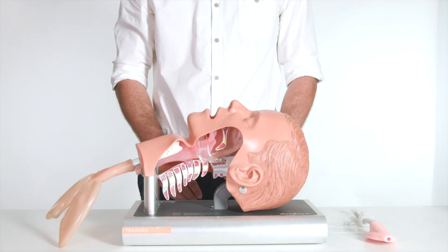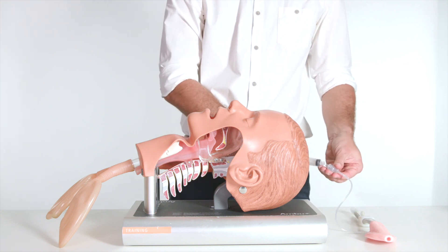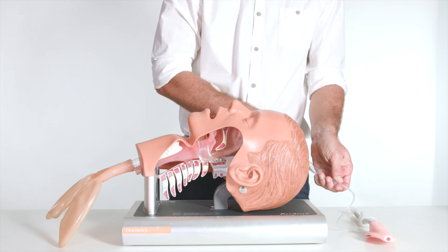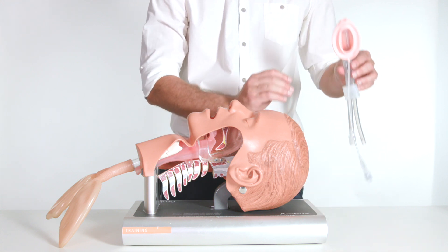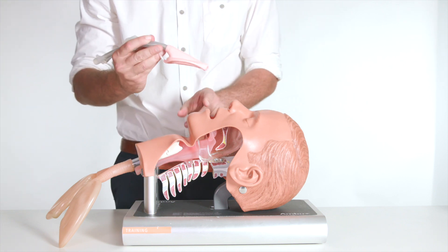In this video we'll be demonstrating the method of insertion. Check the cuff inflation before use and place on a flat surface, then deflate the mask cuff with a syringe, or the mask may be inserted semi-inflated. Lubricate the back plate of the mask and make sure the patient's head is in the sniffing morning air position.